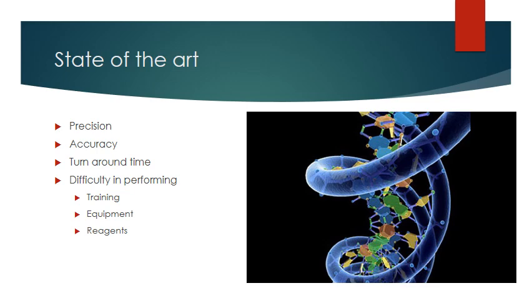In the case of routine testing, a culture takes a minimum of 24 hours, and we rarely return cultures in 24 hours. We usually like to keep them for 48 because of those slow growers. So the turnaround time is wildly improved with molecular testing.